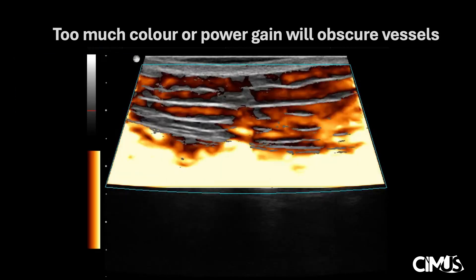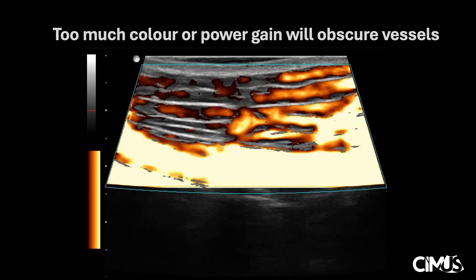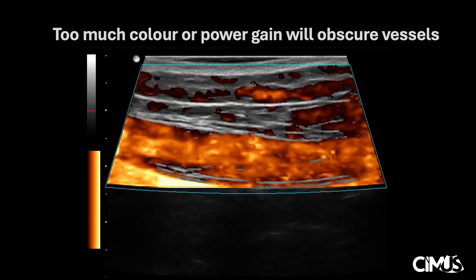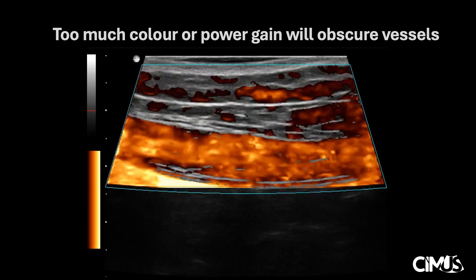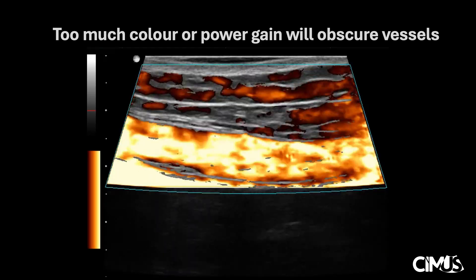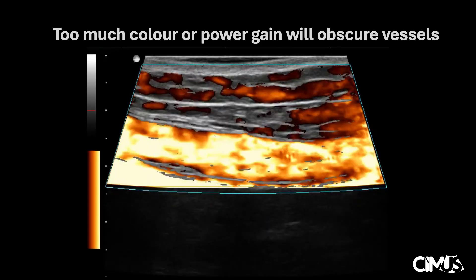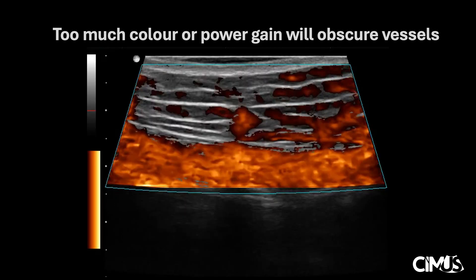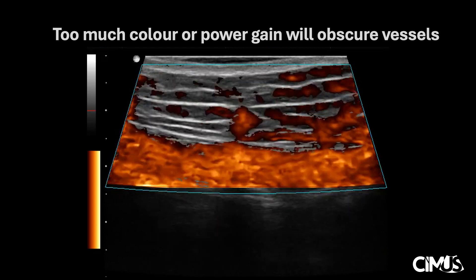Conversely, while too low of gain can miss vessels, having too much color or power gain is also problematic and will obscure vessels. A similar appearance may also occur if there is too much movement, so it's important to hold the transducer still.